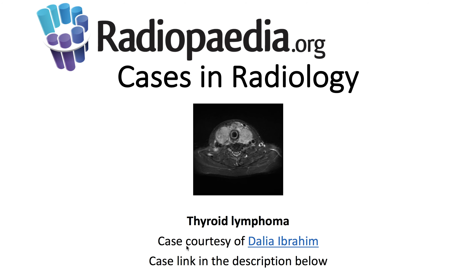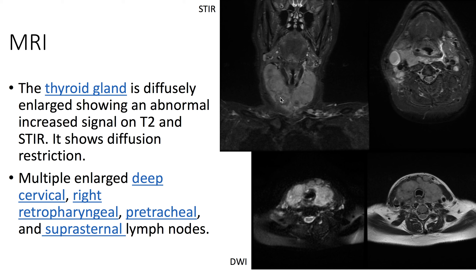Presentation: we have a 50-year-old female presenting with anterior neck swelling. On MRI, we see that the thyroid gland is diffusely enlarged, showing abnormal increased signal on STIR as well as on T2. It is diffusion-restricted on DWI, and we can also appreciate some lymphadenopathy.